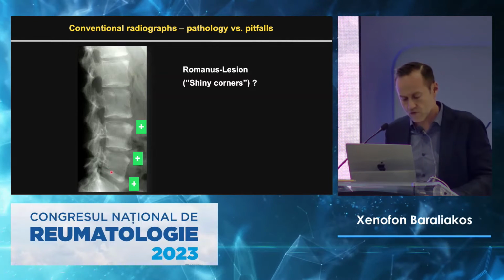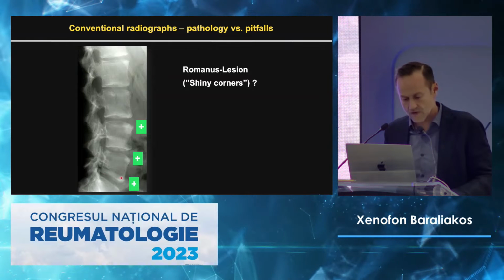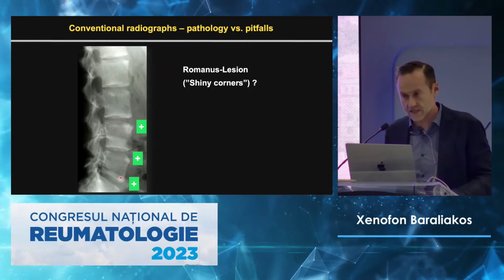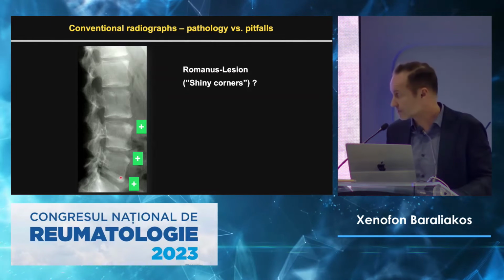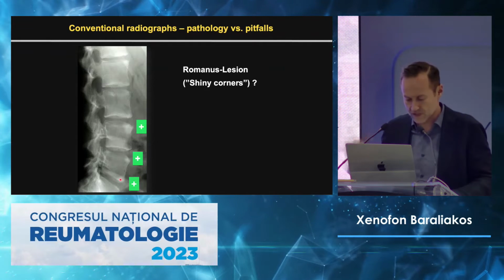Here we have an overlay of the pelvis. However, that corner is even more hyperdense. Sorry, it's very low. I understand that some of you may not see that.